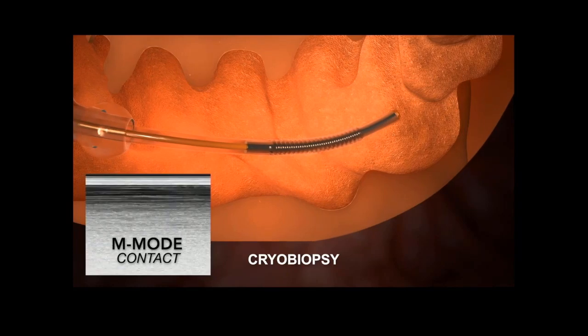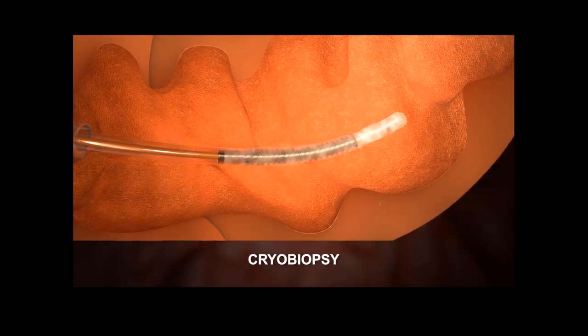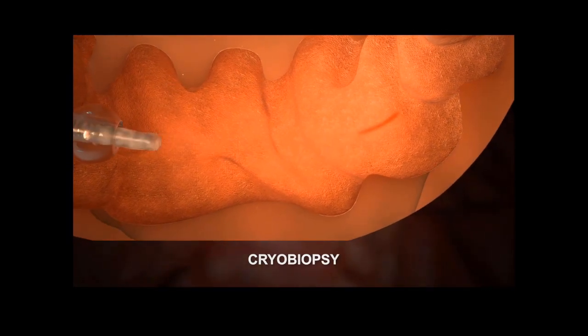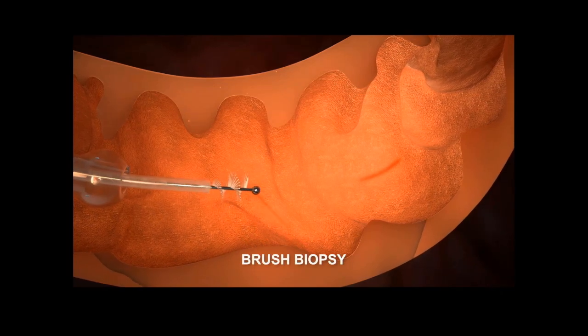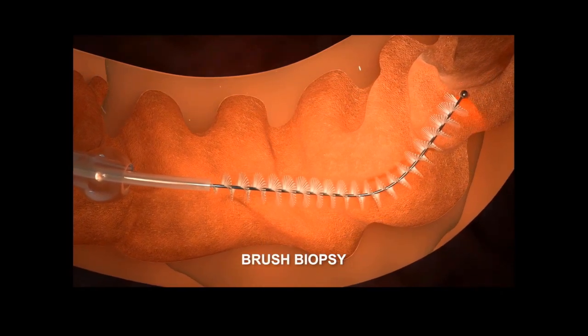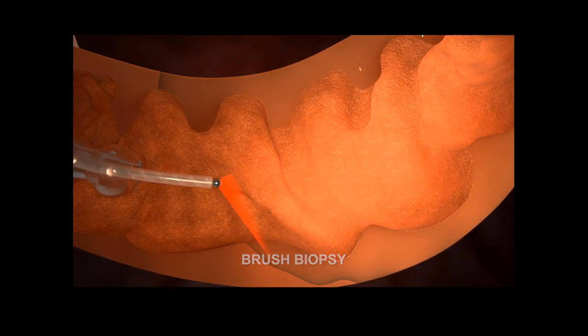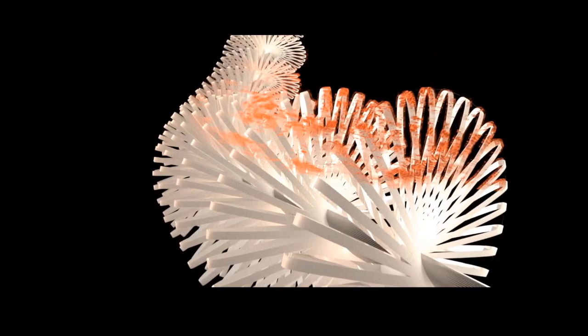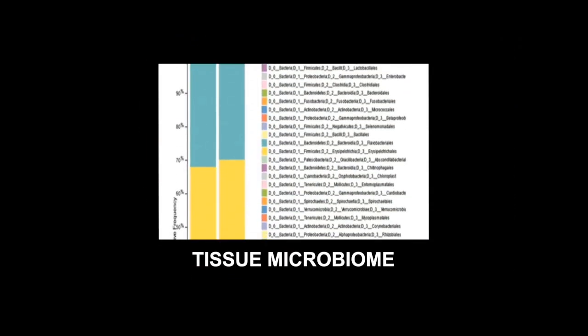And in this case, we have a cryobiopsy probe where we freeze the tip of the probe when it touches tissue. And then when we pull it off, we get a tissue sample. So we're able to minimally invasively get tissue. And the tissue is much better histology than that of a forceps biopsy, because a forceps biopsy compresses and crunches the tissue and causes compression and artifacts. We also have a brush that we bring in to grab the microbiome, and we're able to do sequencing of the microbiome, which is important in understanding and treating this disease.